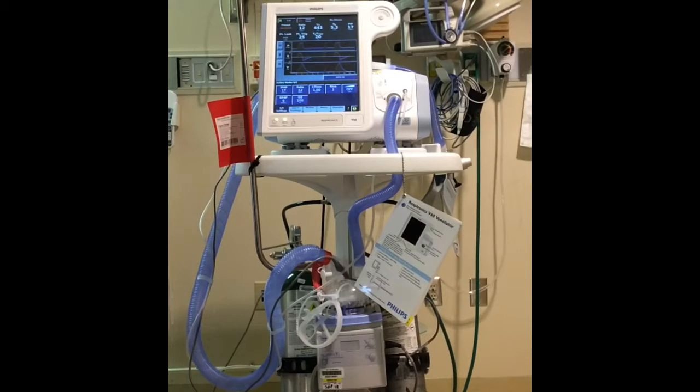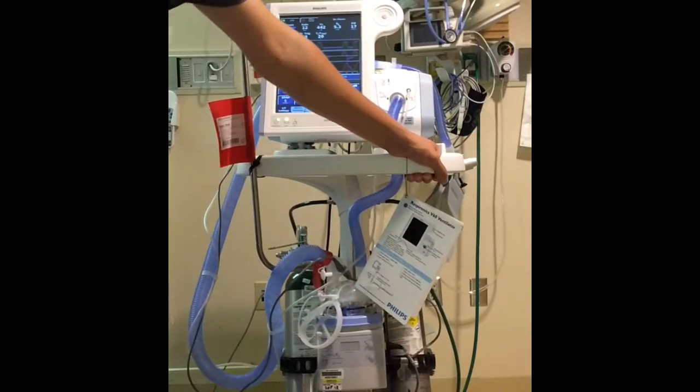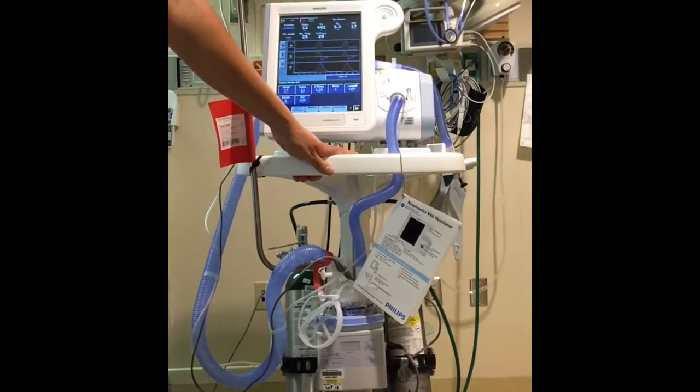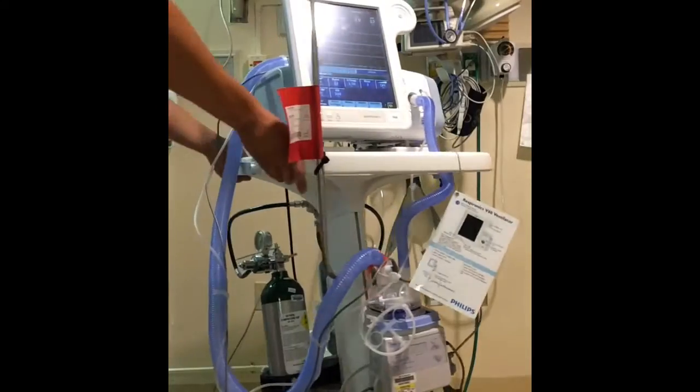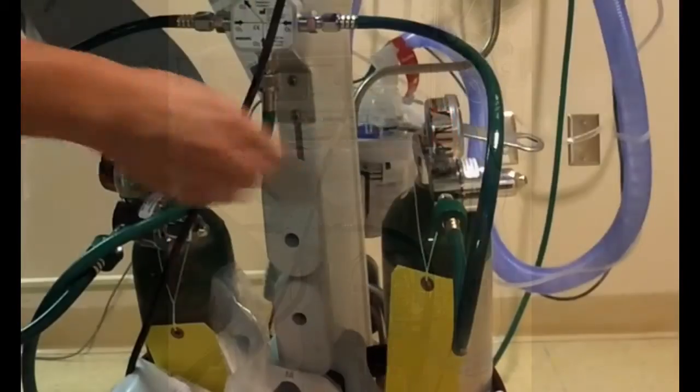Now let's say that you have to transport your patient down to the CT. This machine transports super easy. All you have to do is unplug it from the wall and unplug it from your power outlet. This has a 6-hour battery life, and on the back you're going to see that it has oxygen tanks on the back.